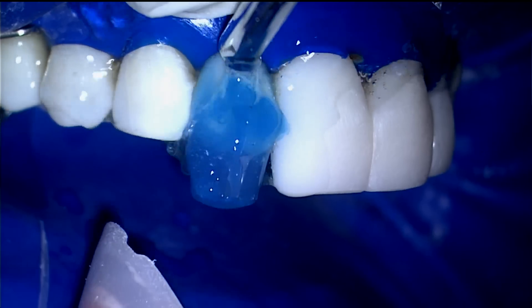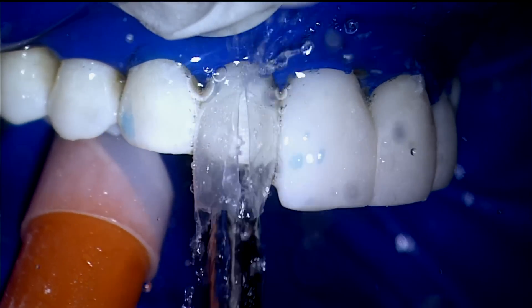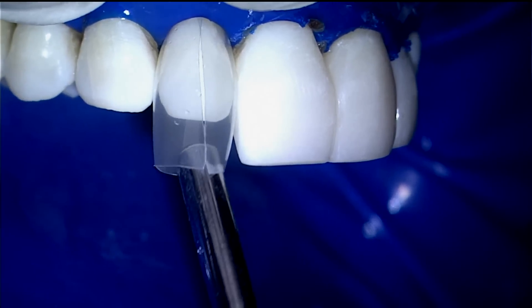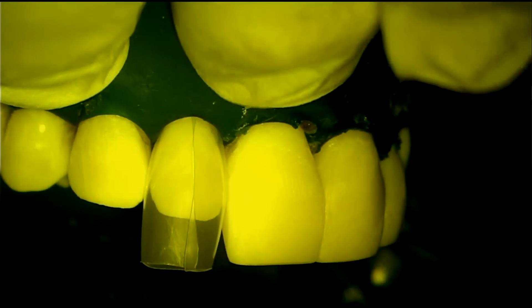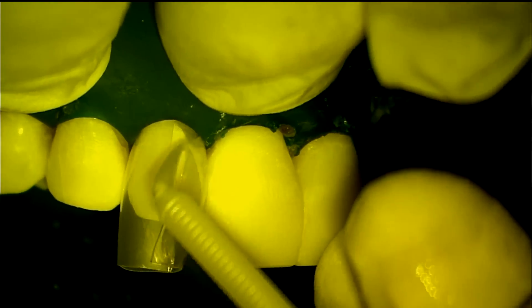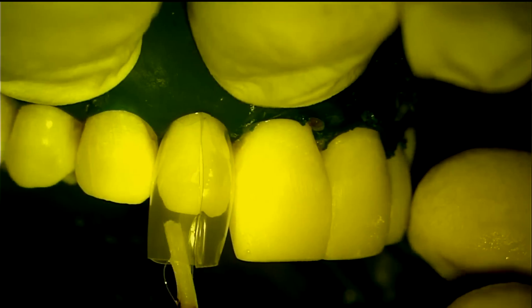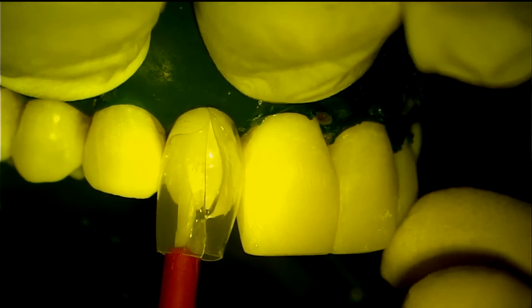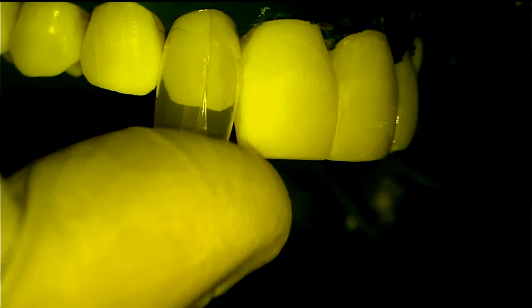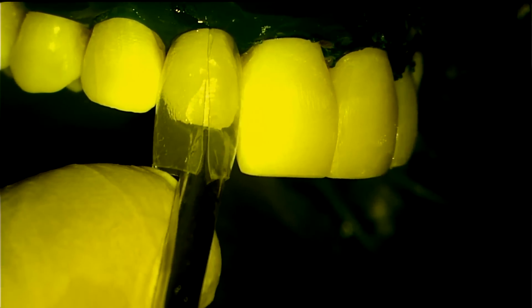Notice how the matrices allow very active rinsing action. Make sure to massage the adhesive into any dentin areas for a full 20 seconds for ideal adhesion and reduction of post-operative sensitivity. Make sure to completely wet all of the enamel with adhesive. The adhesive is air thinned, driving off the solvents, which also allows the adhesive to completely wet the tooth, even in deep interproximal areas.